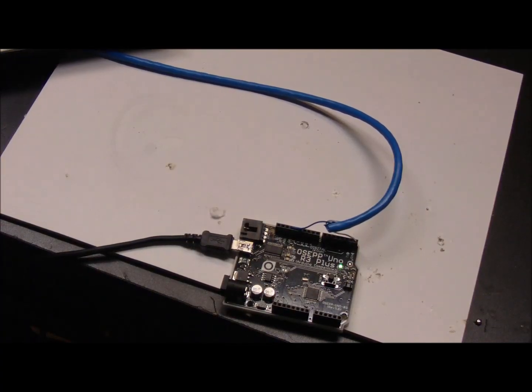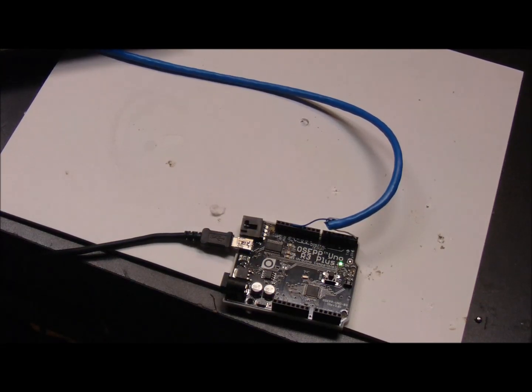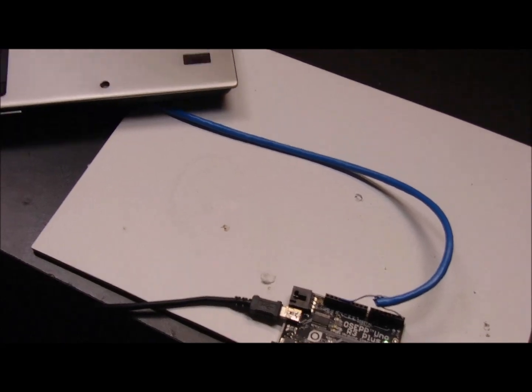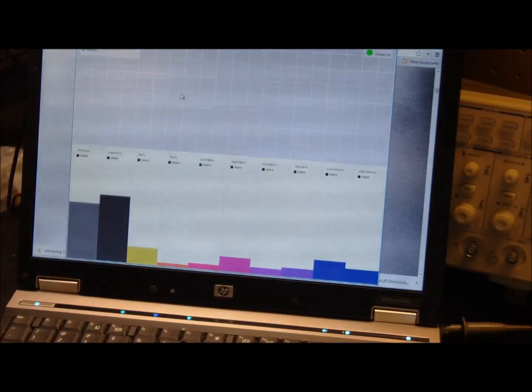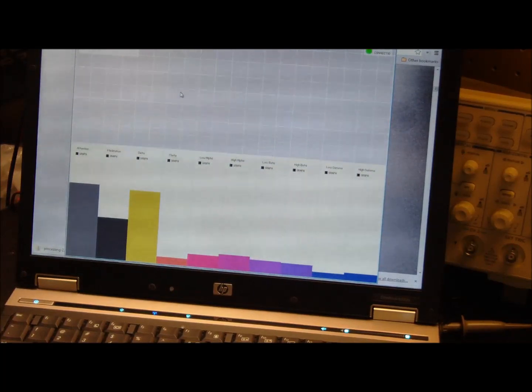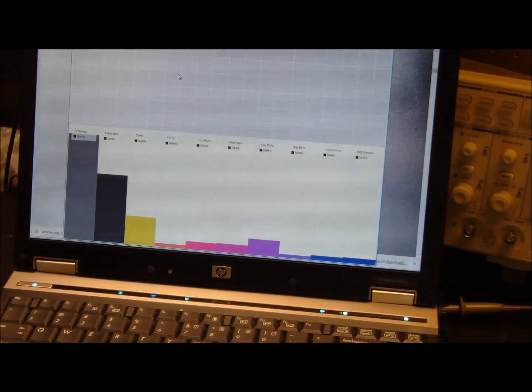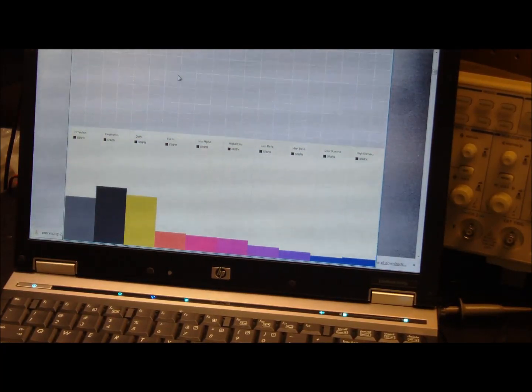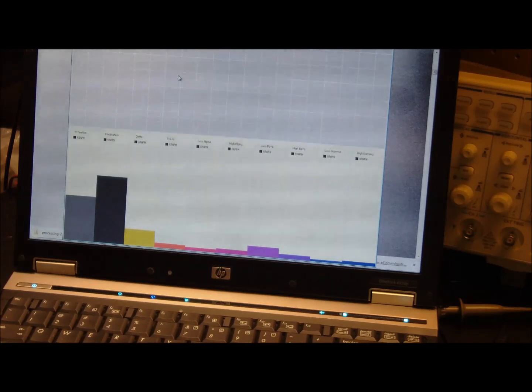So I moved to the 32-bit version, no difference. Moved back to the 64 and discovered it's just as simple as putting the darn thing on your head. So when it's not hooked up and actually receiving a half decent input to the chip, you get nothing. Who would have known? I would have thought I would pick up some interference or something of that nature. This is on my head right now, live. You see my attention is pretty much max of the scale when I was sitting here a few seconds ago before I started the video. It's down to nothing, same with the meditation. It's pretty easy for me to put those right down at the bottom.